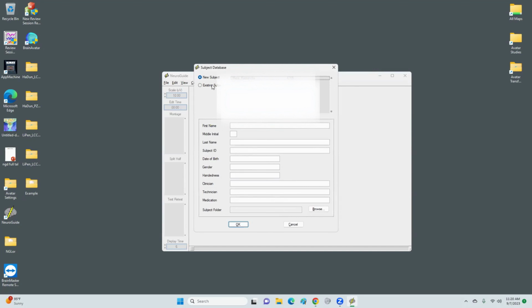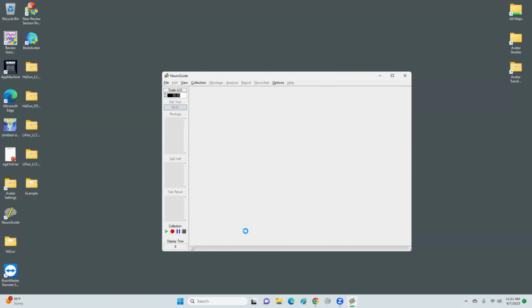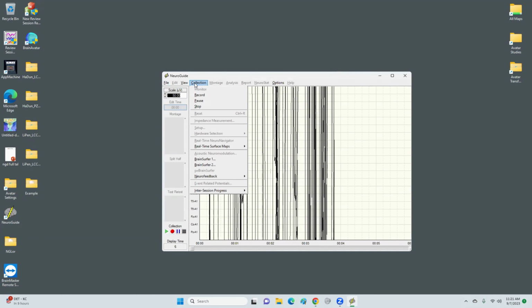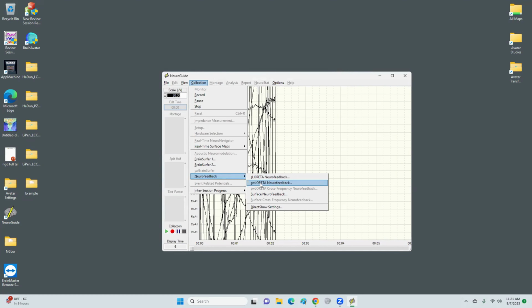Now we can find our existing client right here. We're going to confirm eyes closed. We're going to go to collection. We're going to go to Neurofeedback and swLORETA.